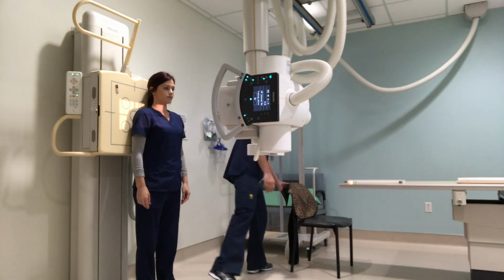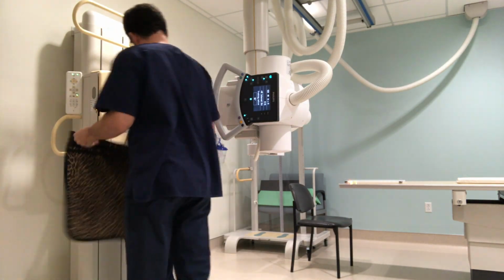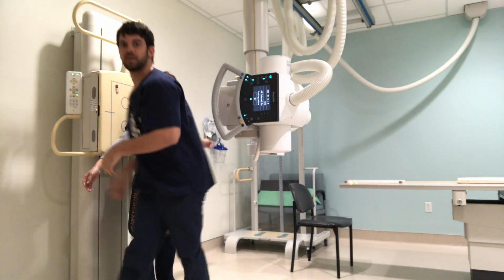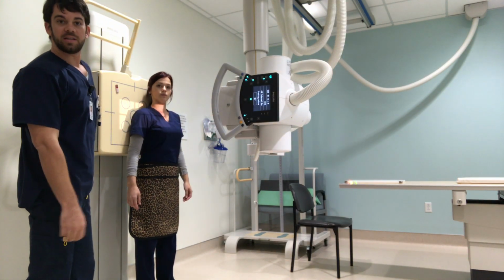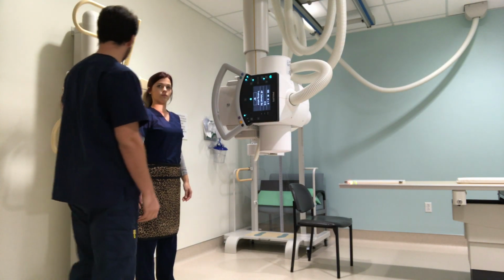I'm going to shield my patient with this extra trendy leopard shield. Can you raise your arms for me? There we go. The good thing about this room is I'm on digital, which means I don't have to run any cassettes back and forth, so this is going to be a quicker exam than normal.